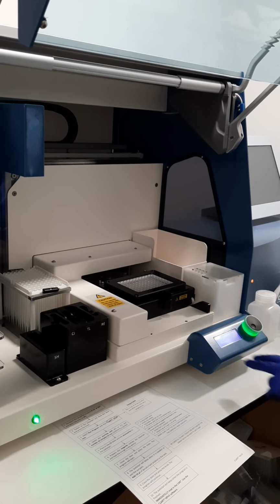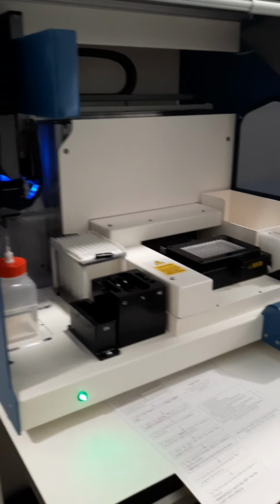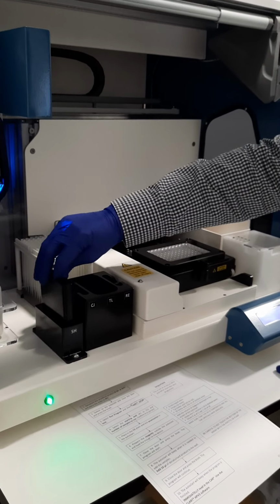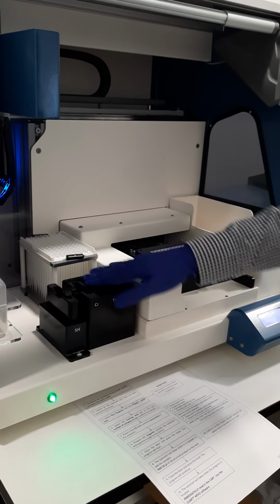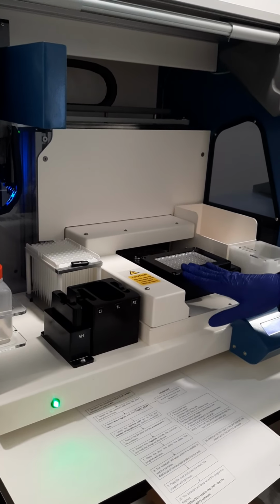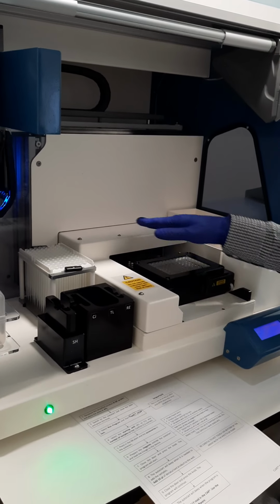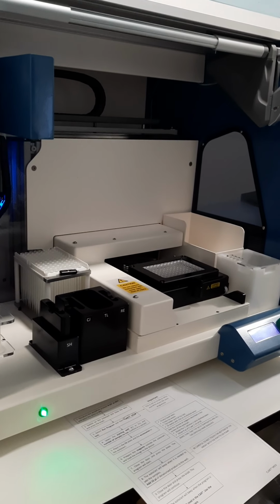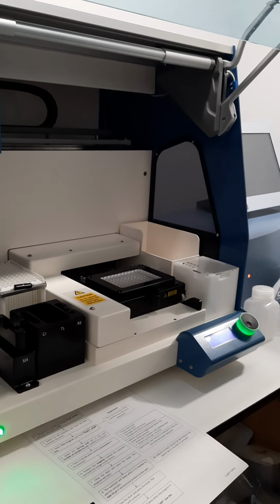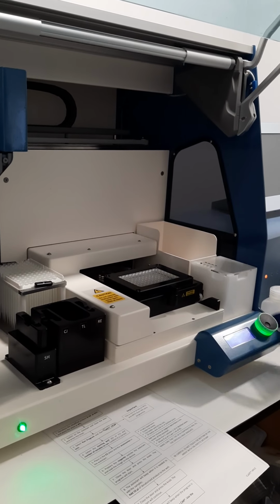Then it's going to ask us to load the water, distilled water, here, the full bottle. Load the TL reagent, that is this one. TL reagent is the wash buffer. The DNA probes that are printed in the bottom of the wells are covered by salts, so we add the TL to remove these salts and have this DNA naked. We are going to add later the DNA of the PCR to hybridize and to detect. Okay, so we'll see. TL is the wash buffer to remove.